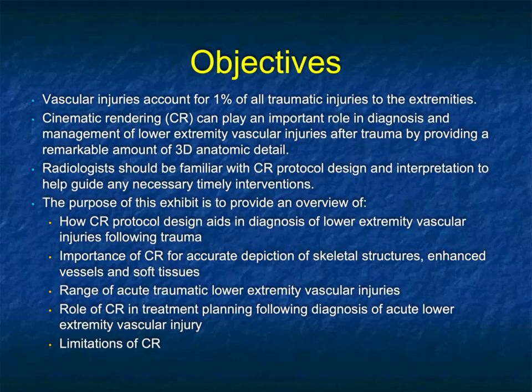Just to be clear, we've published articles in the past on volume rendering, probably more than a decade ago. 3D in general, as we've gone from the classic 3D to volume rendering, now to cinematic rendering, the application has always been there. It's just that we can give more detail. Radiologists should be familiar with protocol design and interpretation.